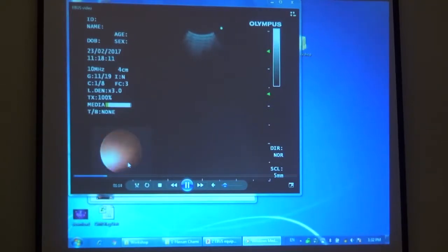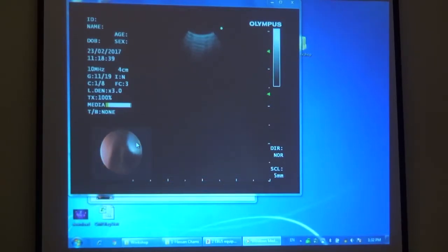And then, here what's happening, this is the carina here. And now they're probably going to deploy the needle, the catheter. So you wait until you see the catheter coming out. This is how much you need. You don't need it to be out too much.